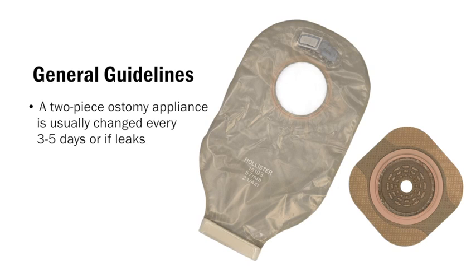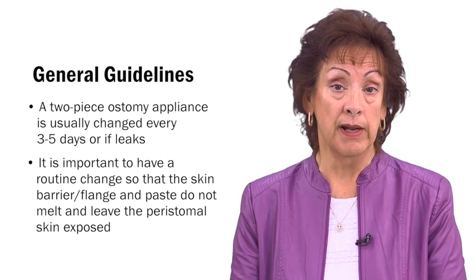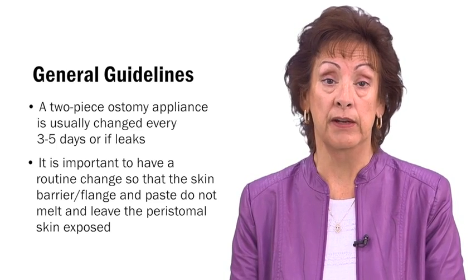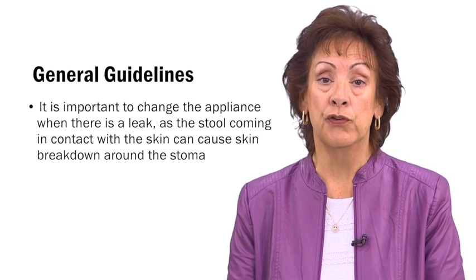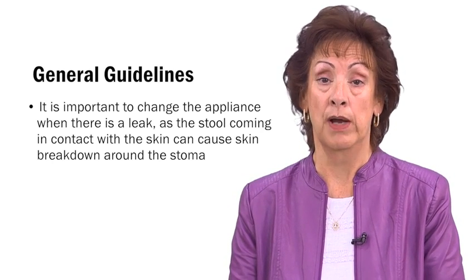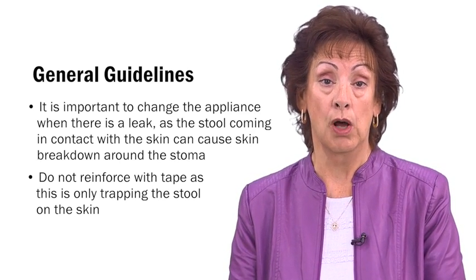A 2-piece ostomy appliance is usually changed every 3 to 5 days, or if it leaks. It is important to have a routine change so that the skin barrier flange and paste do not melt and leave the peristomal skin exposed. It is important to change the appliance when there is a leak, as the stool coming in contact with the skin can cause skin breakdown around the stoma. Do not reinforce with tape, as this is only trapping in the stool on the skin.